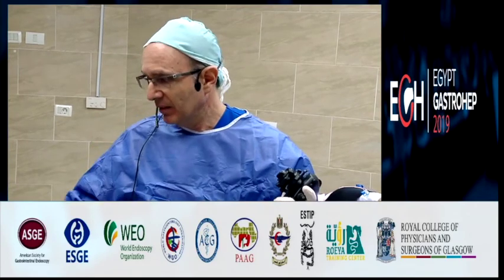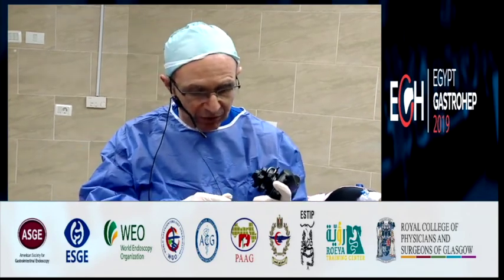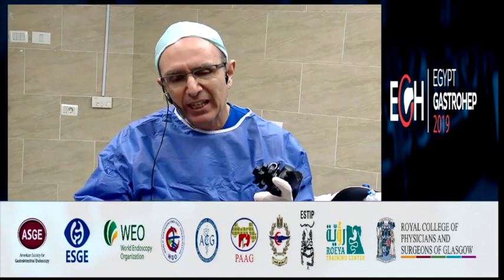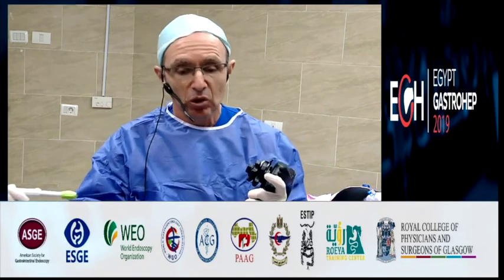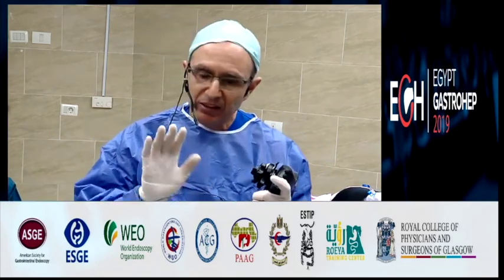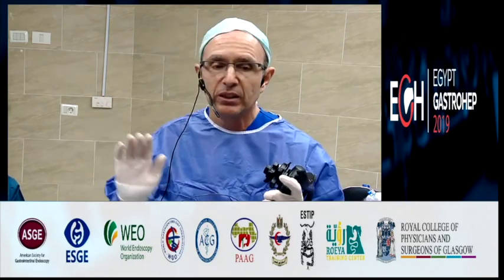You should put this on rapid on-site evaluation with the pathologist, and we can also have MOS, macroscopic on-site evaluation. Macroscopic on-site evaluation is usually done with a magnifying lens, but you can also do it inside, as Dr. Giovannini did. You see the white tissue? So he looked and saw the specimen, the white tissue, and said, no, this is good to put in formaldehyde. So this is a kind of MOS. This is a second pass done here, a very well demonstrated biopsy case.